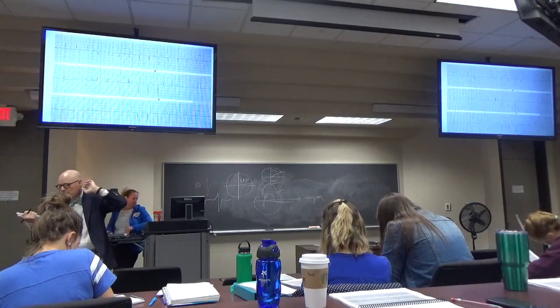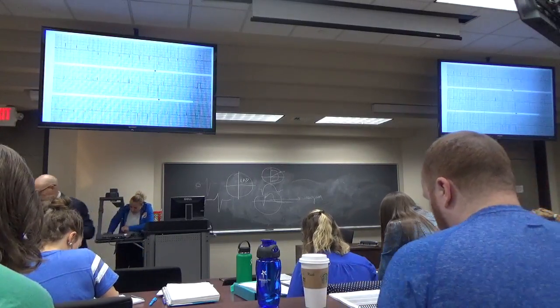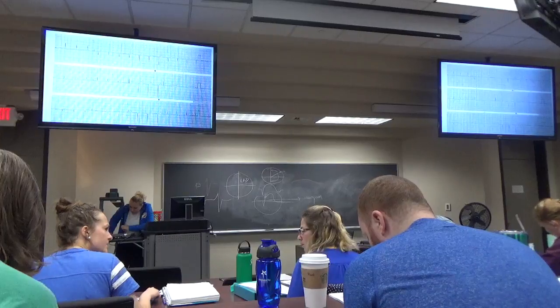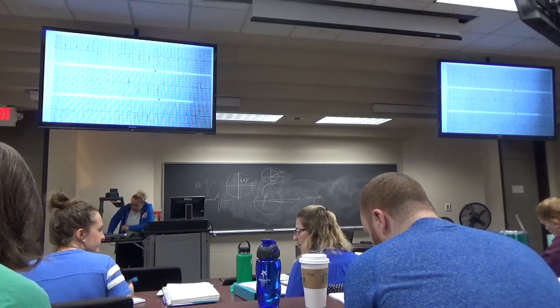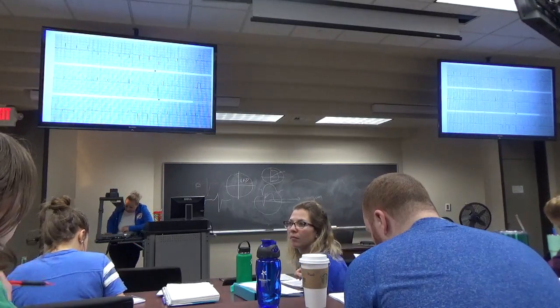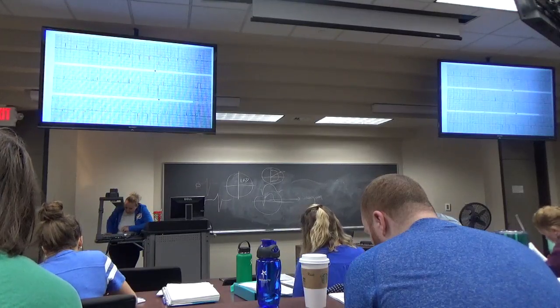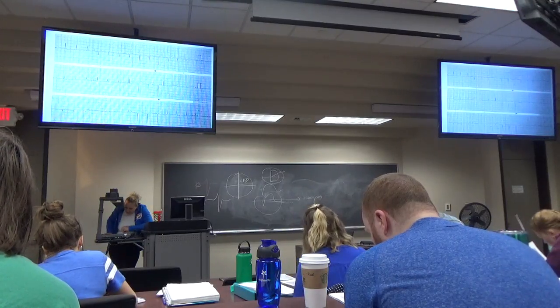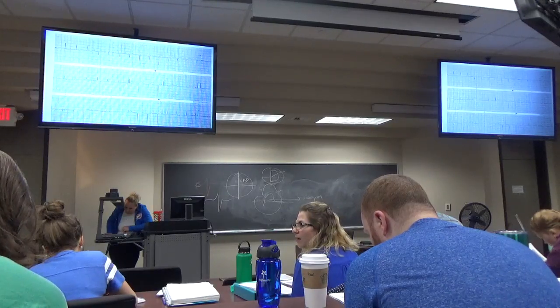That lead two looks weird to me in between the QRS complexes. What looks odd about it? In between the first and second beat, it's wavy, with a few squiggles. Yeah, basically.